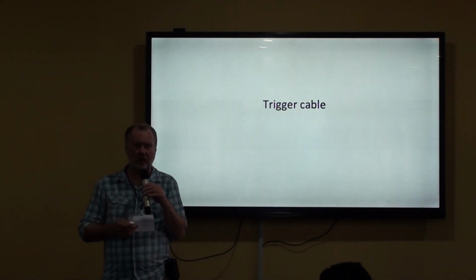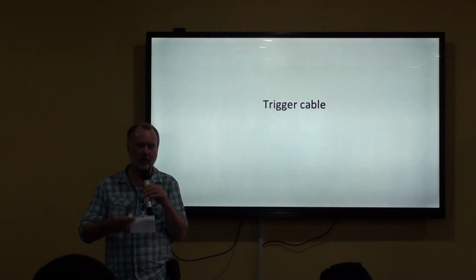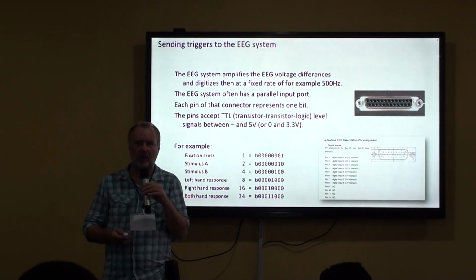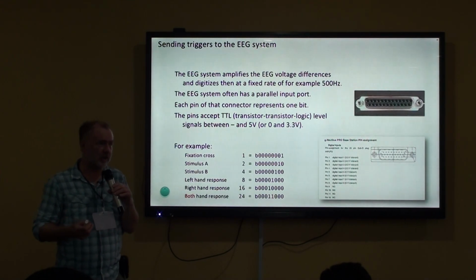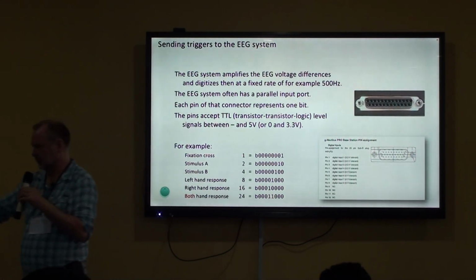If we send a trigger, we need to have a cable between the computer that is doing the stimulus presentation and the EEG system. And for that we often use a trigger cable. Actually, let me just get one.